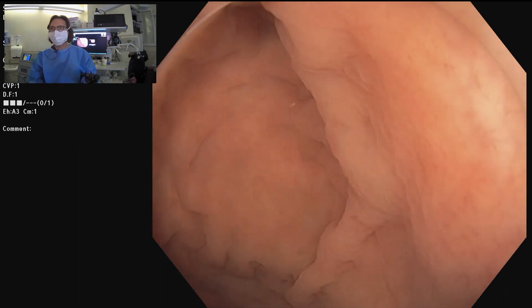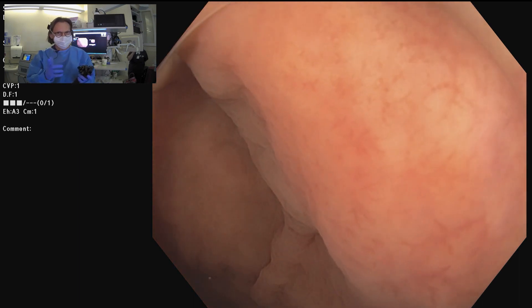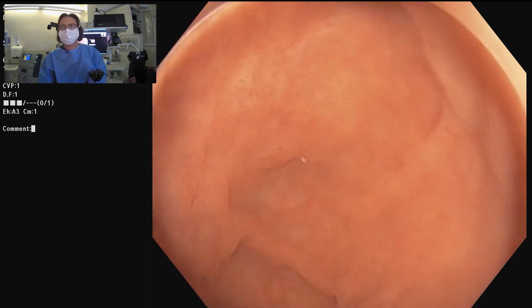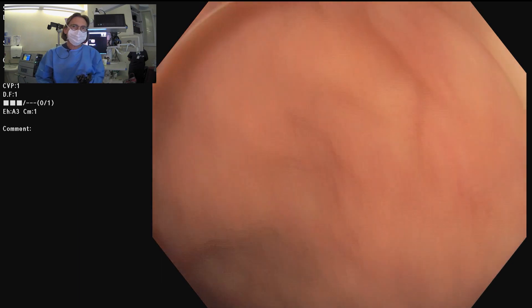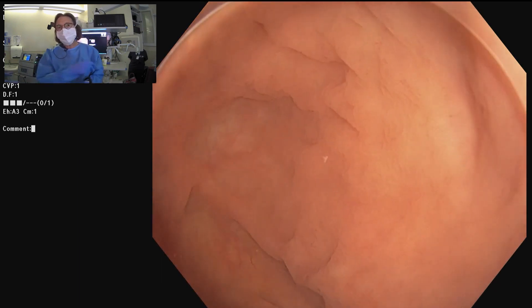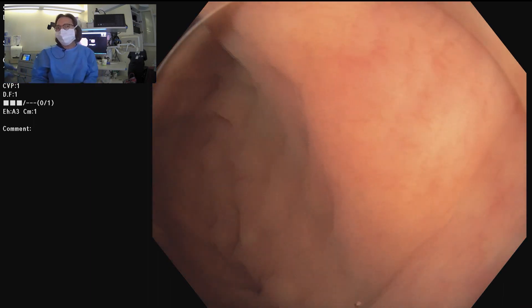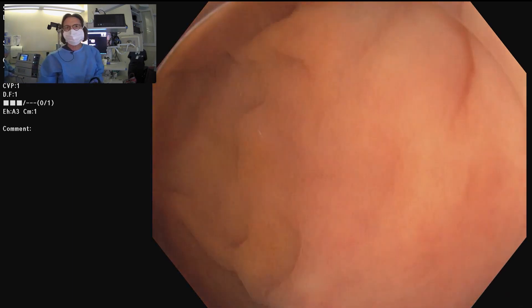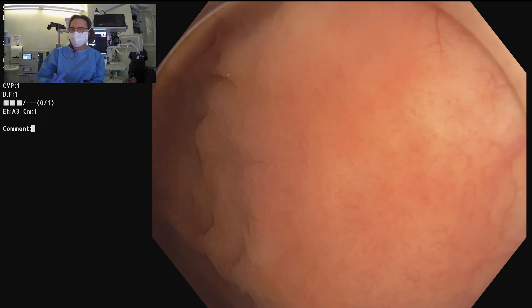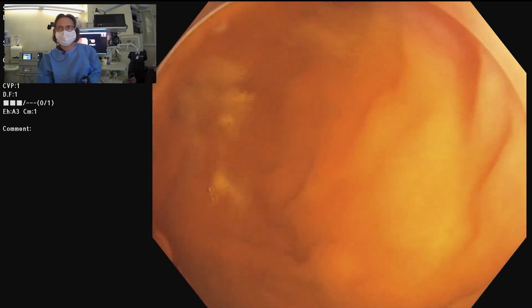Very quickly about the equipment we're using: this is an adult colonoscope with near focus. I'm looking at the appendiceal orifice using water infusion — water exchange, as we call this. The gas has been turned off the whole time, so there should be very little residual gas in the lumen. As I went up to the cecum, I was doing water exchange — pulling out gas and replacing it with saline, though we call it water.